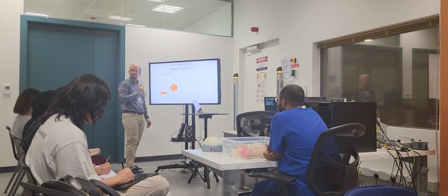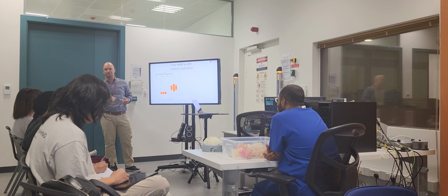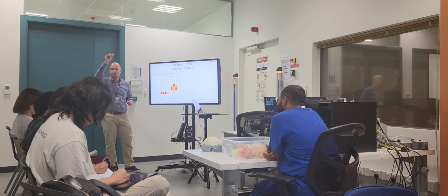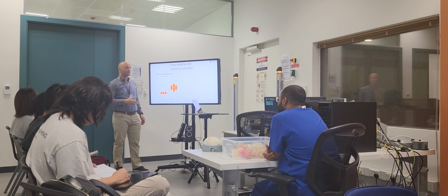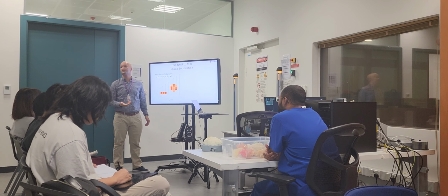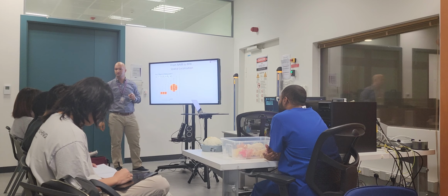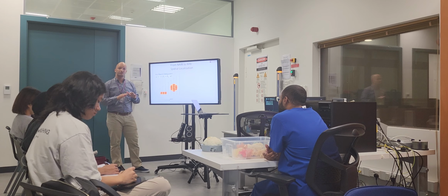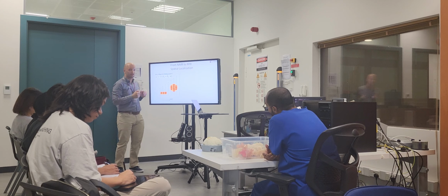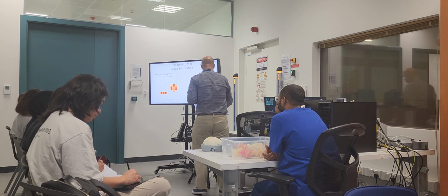I have 7 Tesla, and I say 10 millitesla per centimeter, 80 millitesla per centimeter, whatever. It's just a small amount of millitesla, I just need to taper it. What happens when I taper it? Then my system doesn't have the same Larmor frequency anymore. The Larmor frequency is going to be spatially dependent. It's going to have a spatial component to it. We can do this in the Y, we can do this in the Z. So that's all we do. We just add a gradient, we apply the pulse, we record the signal, and that's what we get, an FID.